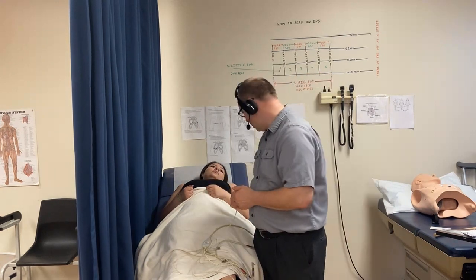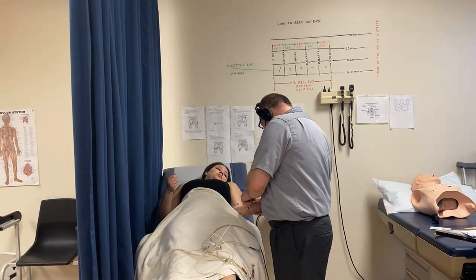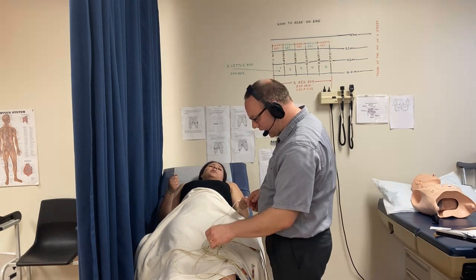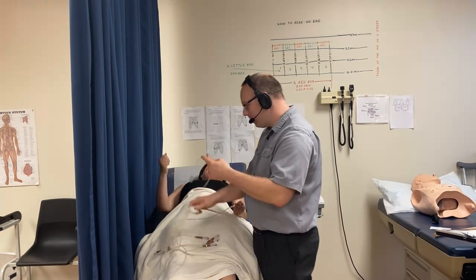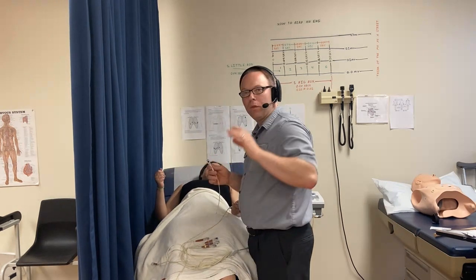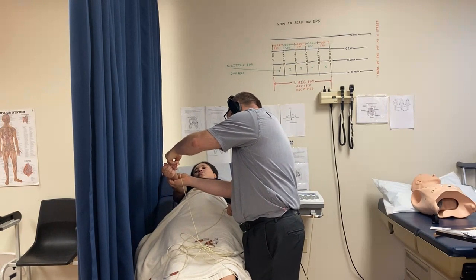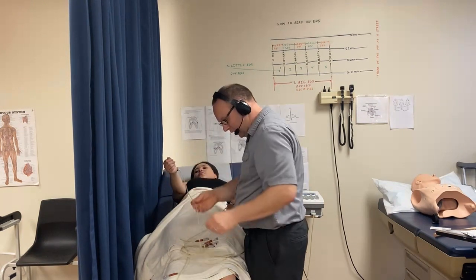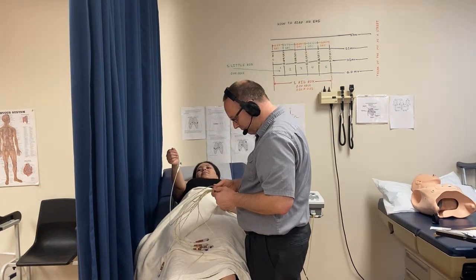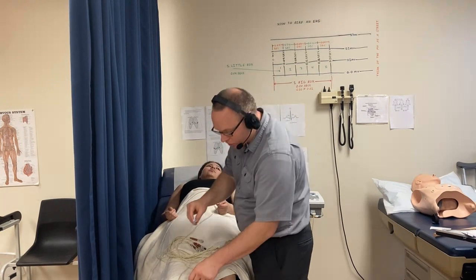'LA' is short for left arm. To make sure you have right and left correct, you can ask: 'Ma'am, can you raise your right arm?' Make sure your eyes are oriented the same way as the patient's. Double-check it a couple of different ways because that's the number one reason for a messed-up EKG. 'RL' is short for right leg.